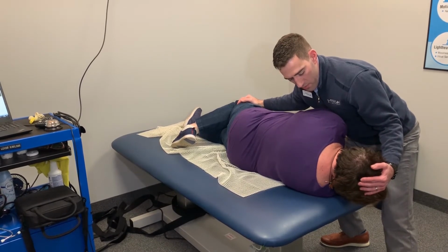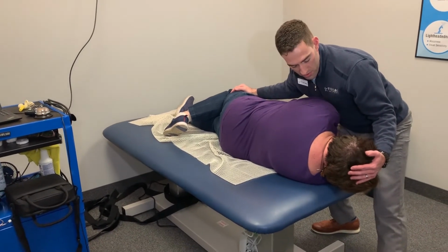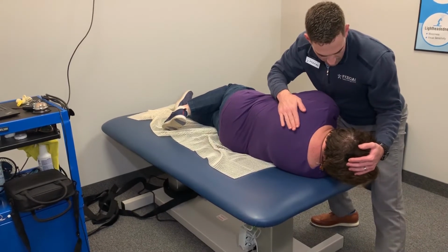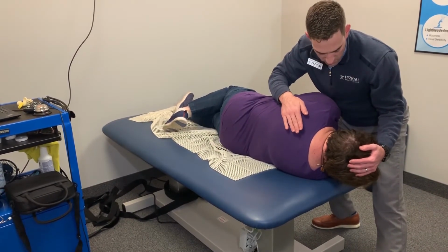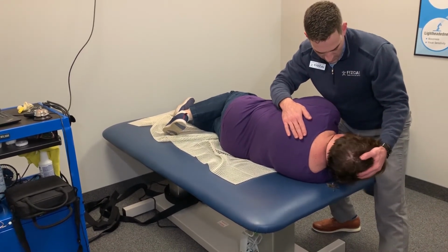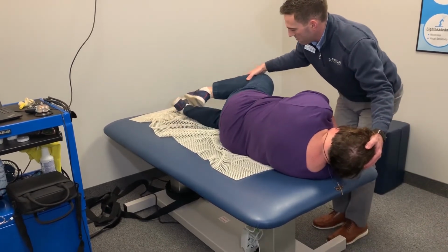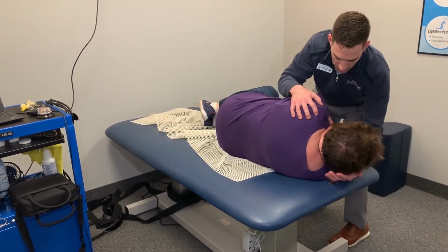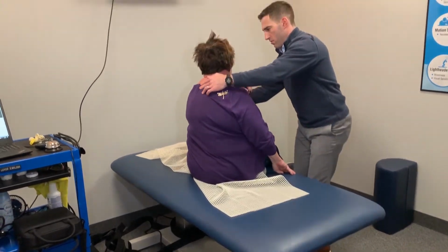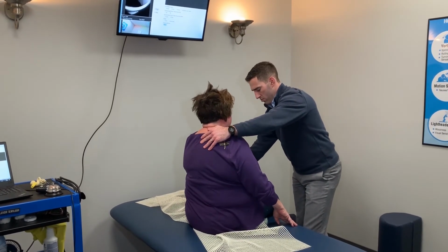So they usually get a little bit of dizziness here, and that's a good sign that things are moving like we want them to. And it usually eases pretty quickly, a little bit better there. It did ease quickly. Sometimes we just do a few little pats or use a little vibratory oscillator to get some of those crystals moving. I'm going to bring your head back up into this position. Okay, go ahead and bring your feet up this way. I'm going to have you just sit right up on the count of 3. 1, 2, 3. Okay, a little bit of dizziness there too. Okay, go ahead and scoot up this way.